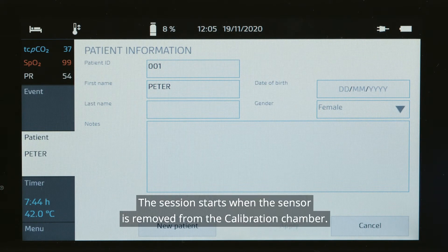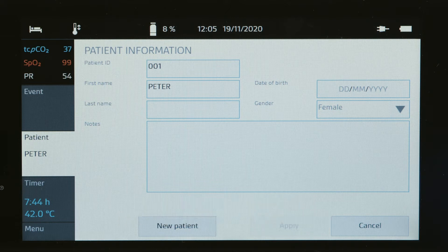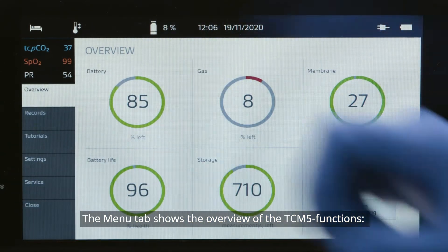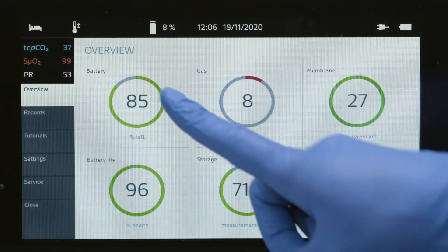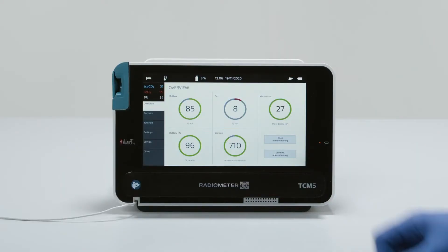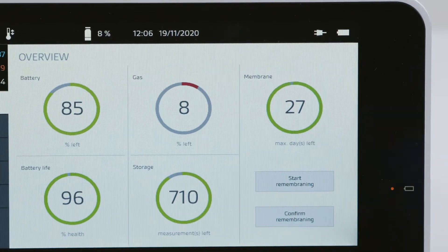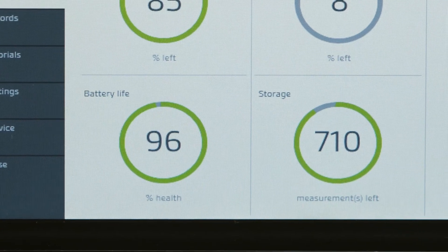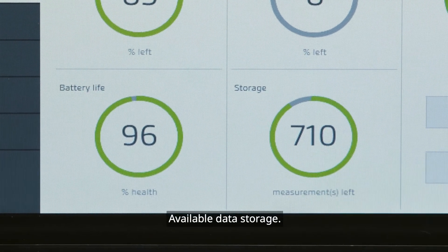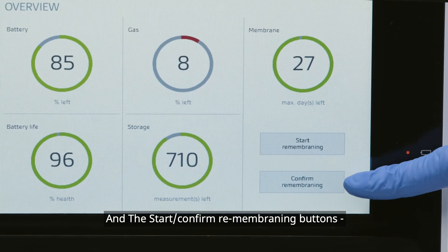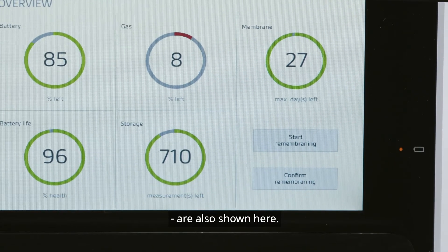The session starts when the sensor is removed from the calibration chamber. The Menu tab shows the overview of the TCM-5 functions: battery charge, gas level, remaining membrane life, remaining battery life, available data storage. The Start and Confirm remembraning buttons are also shown here.